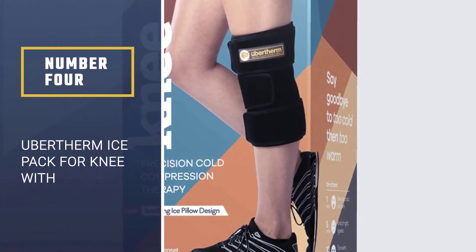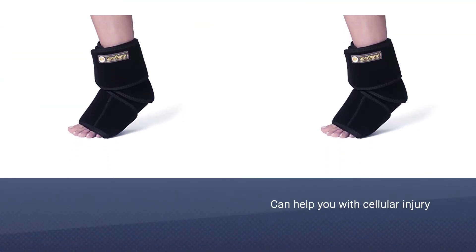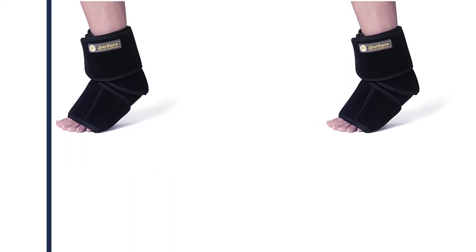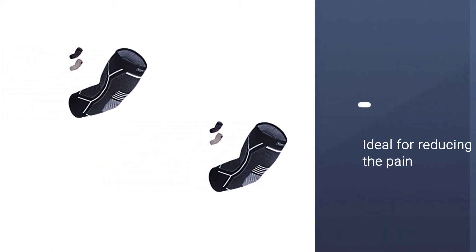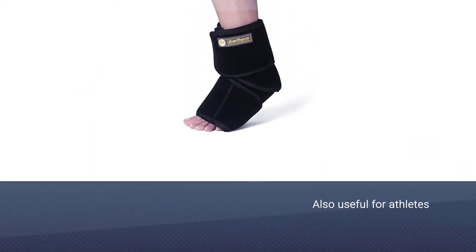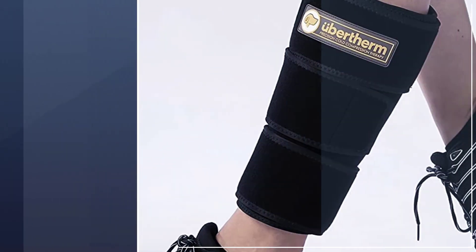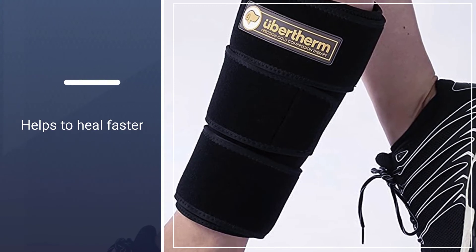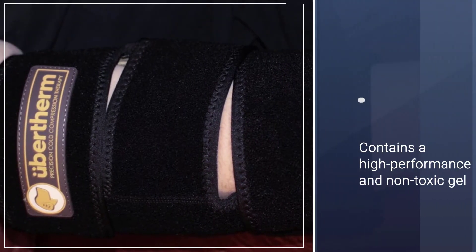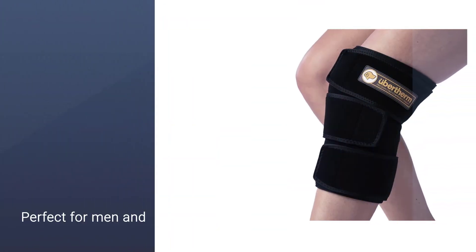Number four: Ubertherm Ice Pack for Knee with Compression. The most interesting thing about the Ubertherm knee ice pack is that cooling without freezing is the trick to faster body healing. It can help with cellular injury, brittle injury, and nerve damage. The wrap is ideal for reducing knee replacement surgery pain or chronic inflammation, and is also useful for athletes and physical therapy. It contains a high-performance, non-toxic gel for soothing cold, and is suitable for both men and women.